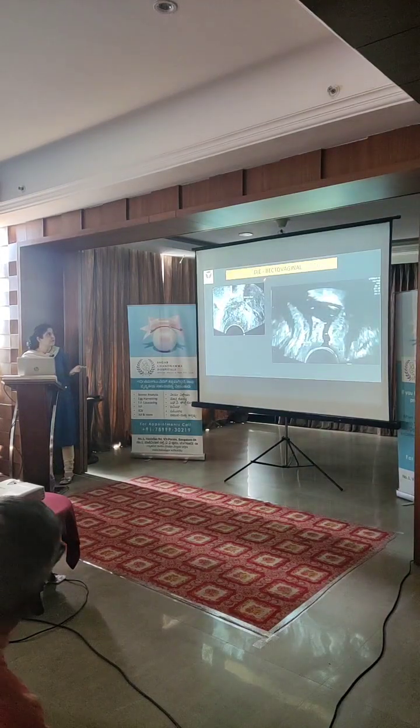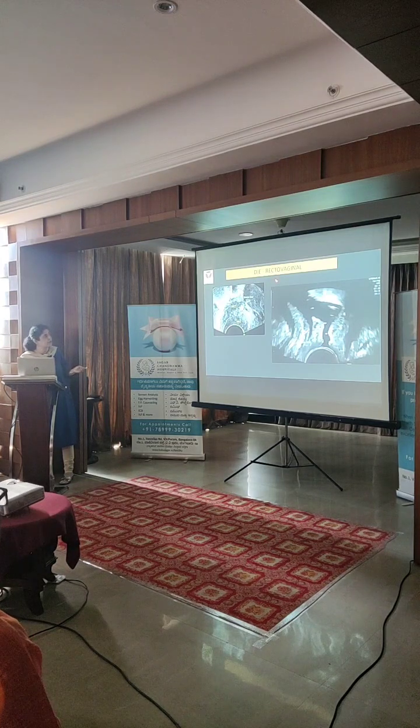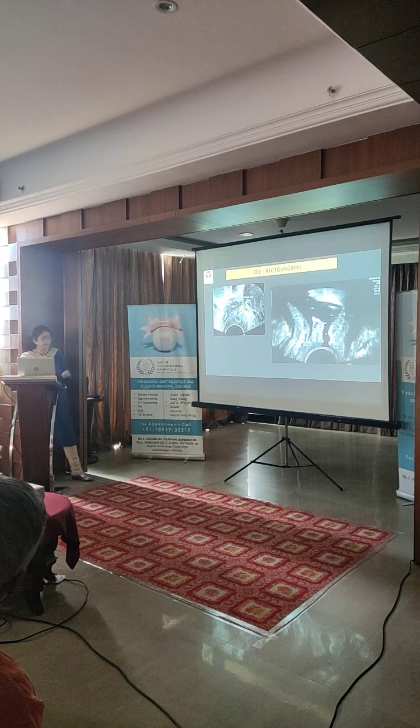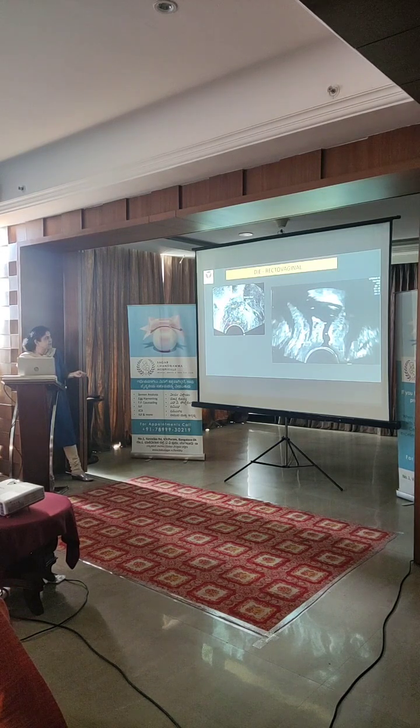uterus. Now, rectovaginal DIE is very often seen along with rectal DIE. So many of the clinicians will send me a patient saying, I'm feeling some nodularity in the vagina or a mass in the vagina. And this is what happens. So this is the normal rectovaginal septum. Here you see there's a breach and the rectal DIE is adherent to the vagina. It's continuous with the vaginal DIE.